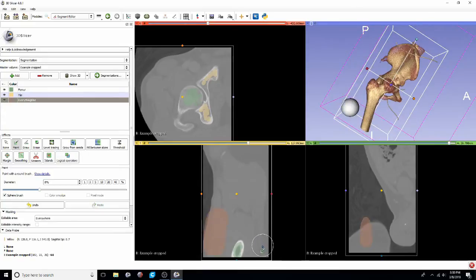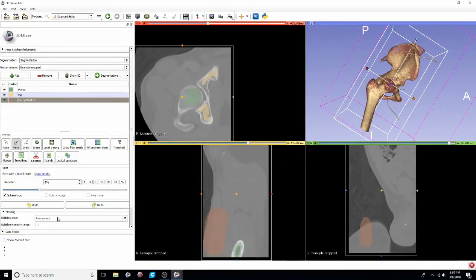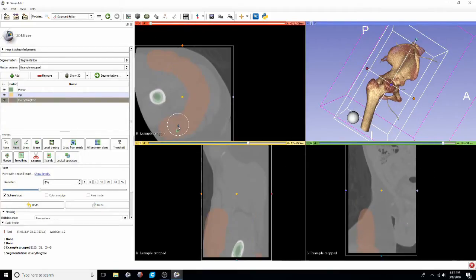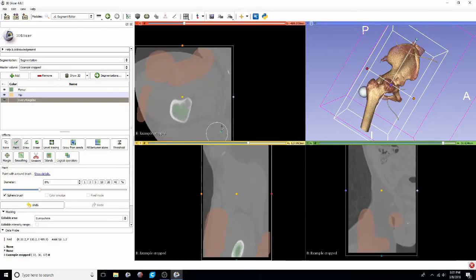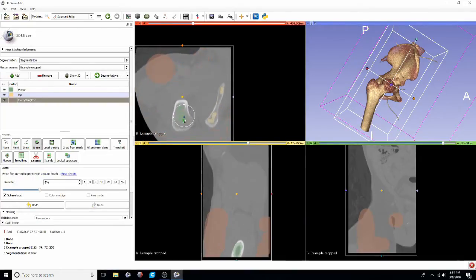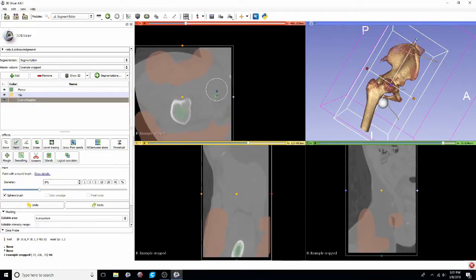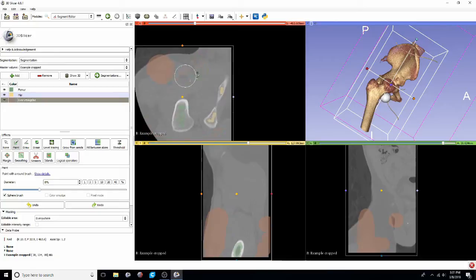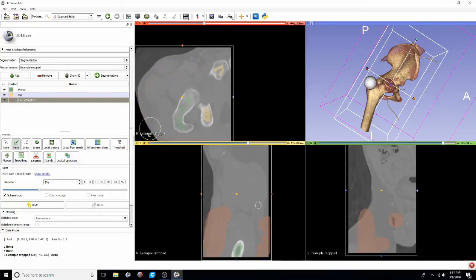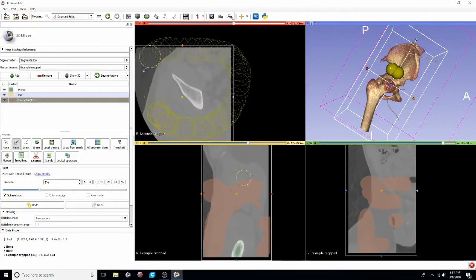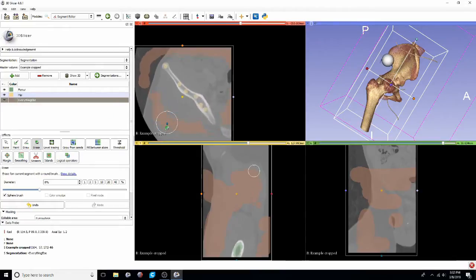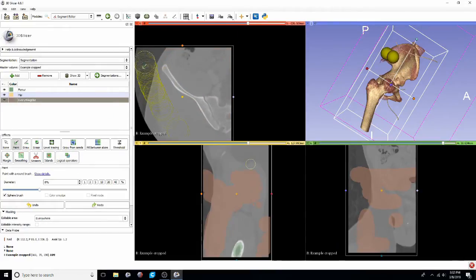Once you've labeled the structures of interest you have, you'll want to go through and label everything else. So for this particular segmentation, that'll be all the muscle and any bony structures that aren't the hip or the femur. Again, the more data, the better.